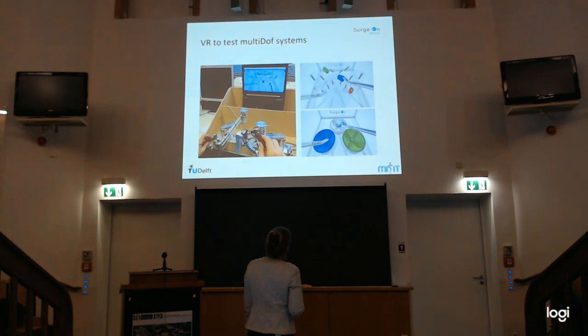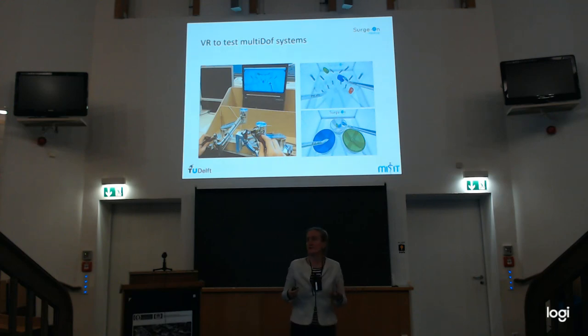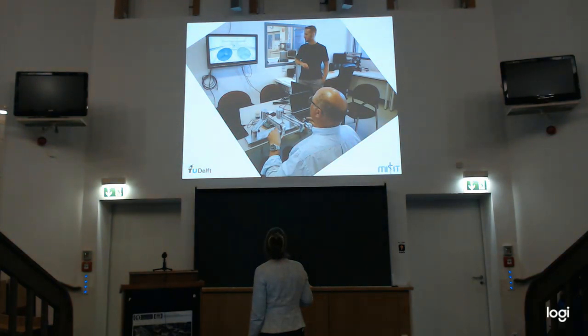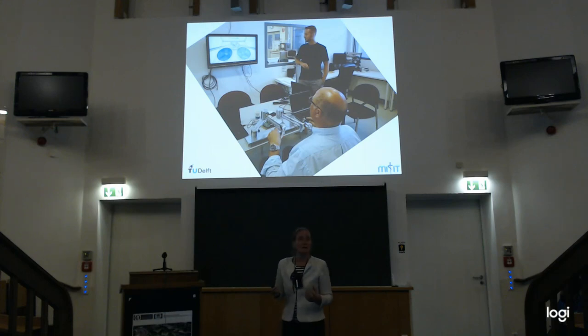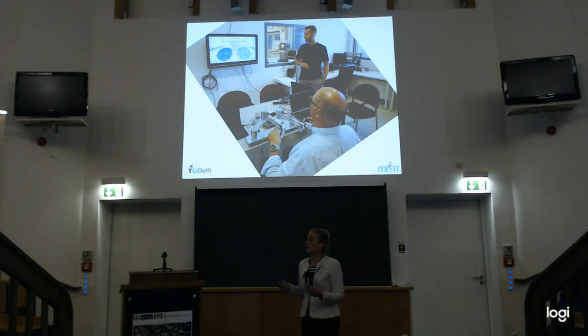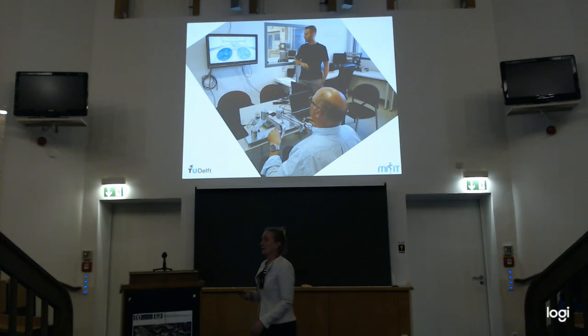Well, yeah, and we know that we have an internal interface for that, and we did all kinds of studies on how big the tip should be, how to steer the tip, how it should work, how it's intuitive, and the physical interface for our people to make all kinds of experiments with it. And see how one of the persons from the startup company is also trying to steer this tip in an individual way. And you don't need to make the design first, but then you can do the simulation, and in the simulation, you can easily change parameters and then optimize it, and then finally make a design of how to do it.